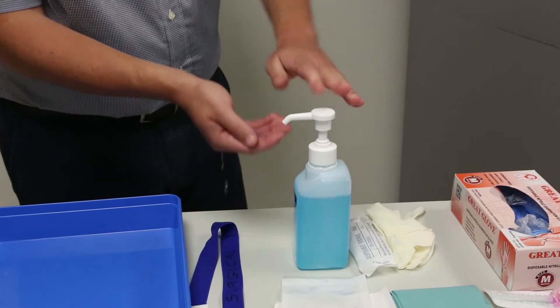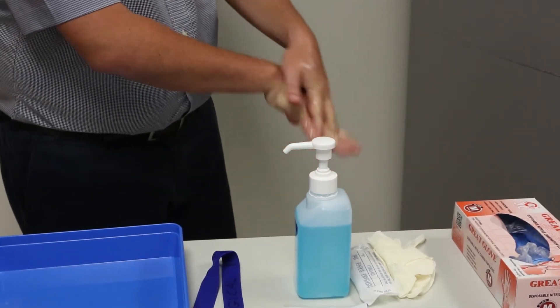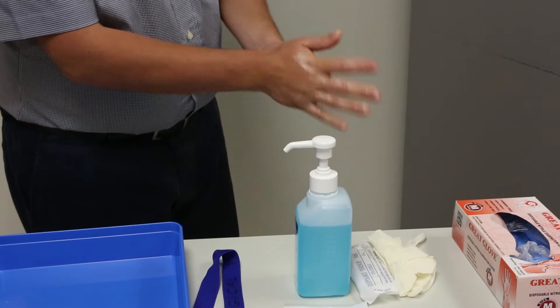Step 5. Clean your hands with soap and water or alcohol hand rub. Remember to use the correct hand cleaning technique.